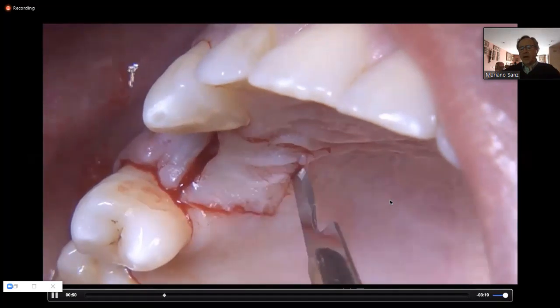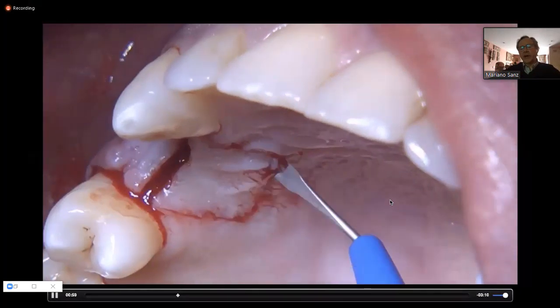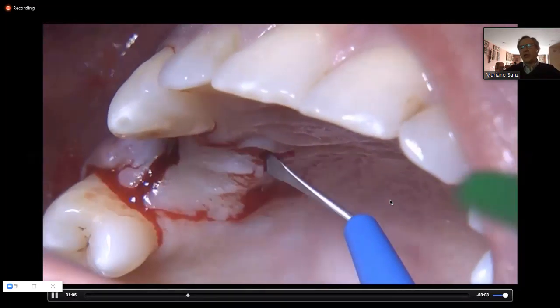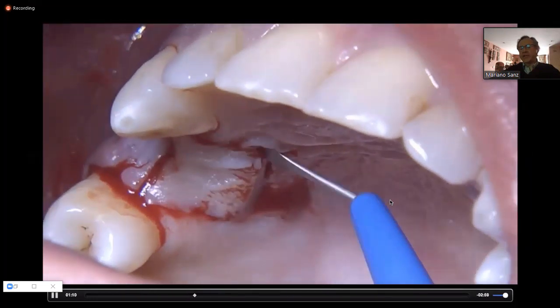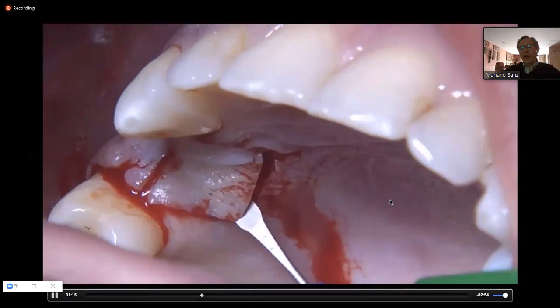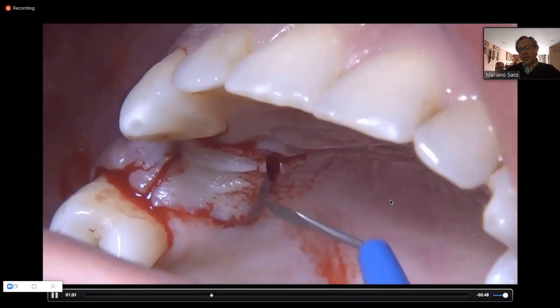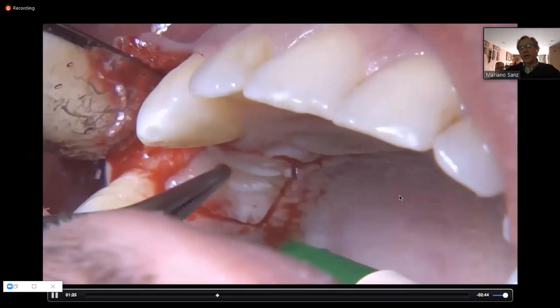And in this manner, we have a big space under the suture that we can basically maintain with the matrix, and this scaffold effect will allow the ingrowth of tissue and will allow the thickness augmentation. You see how this so-called island flap allows the movement of the palatal flap in a coronal direction, and this will avoid any pressure.